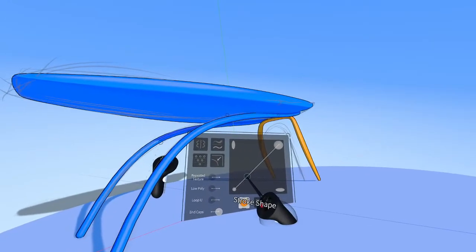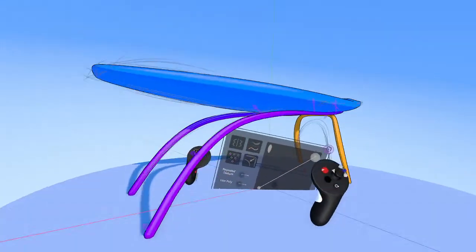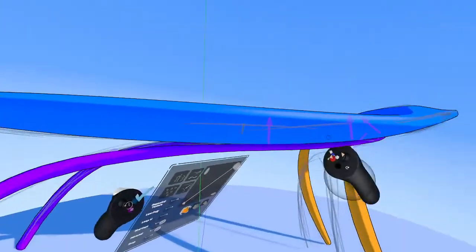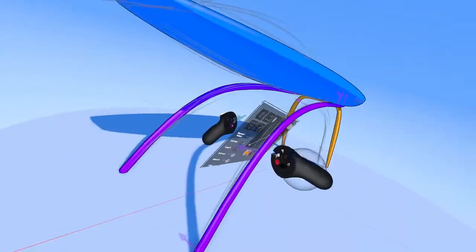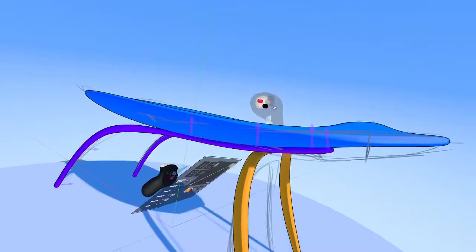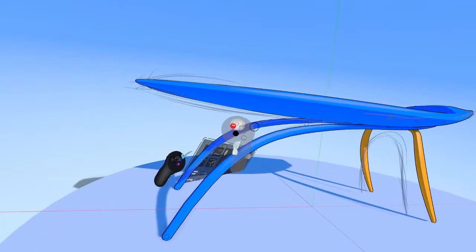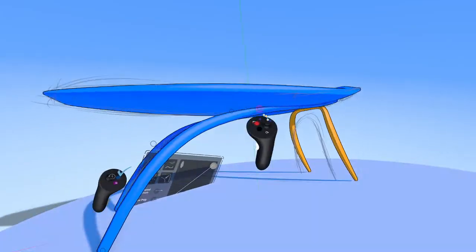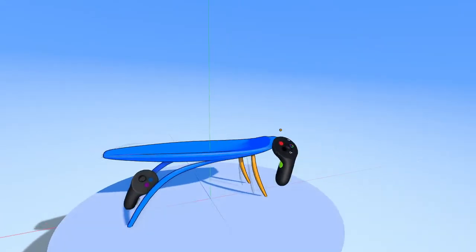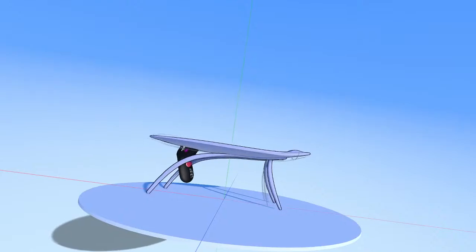So I'm going to do the same thing back here with this guy. Give it somewhat of an oval shape. And let's see what those normals are doing. I actually kind of like it flat here and then rotating in a different direction. It makes it look dynamic. All right, flick back to the other normal edit points, and then grab some of these and scale them up so that the leg looks beefier here than it does over there. All right, let's grab that, make it all the same color here, and I'm going to take a look at the comments now.